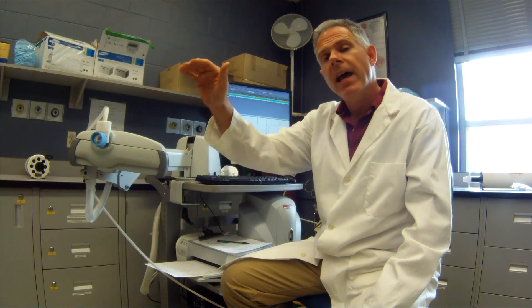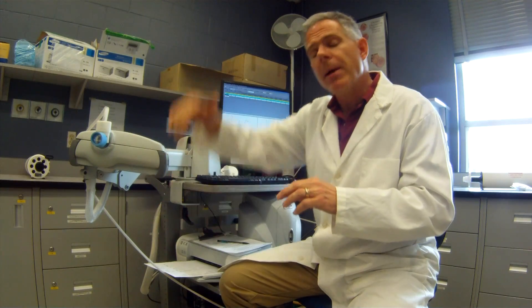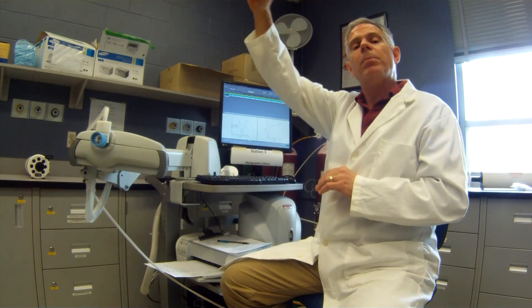So the patient just breathes nice and easy in and out. And then when we feel that they're ready, we'll tell them to take a big breath in. And as they're doing that, we're going to trigger the machine so that they'll be breathing in 100% oxygen.